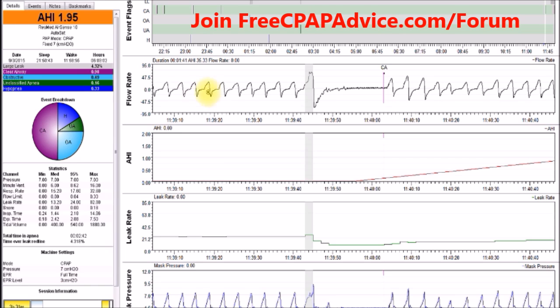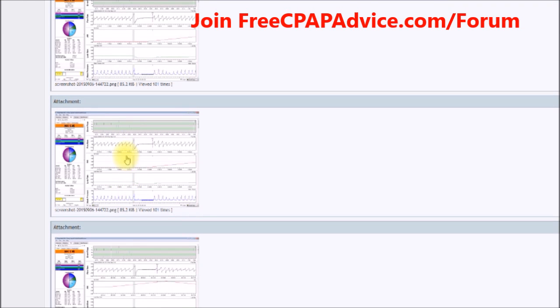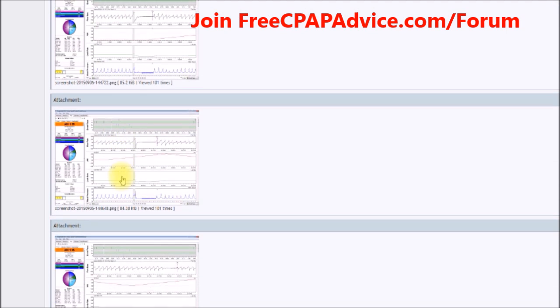What I said was: if you see a flow rate like this with a big spike in front, then a decrease, then the central apnea, then normal breathing - this is almost always a sigh or a yawn. We have no EEG to clarify, but actually I do have an example. You can see the big spike and then flat - it looks like a central apnea, but it's not.